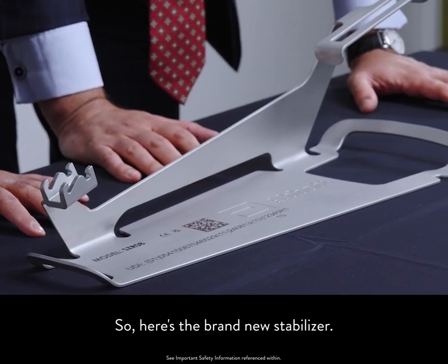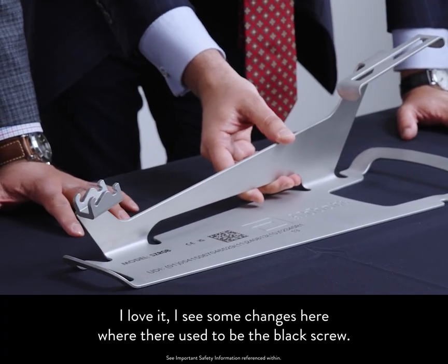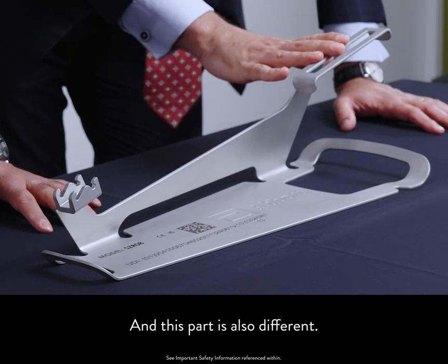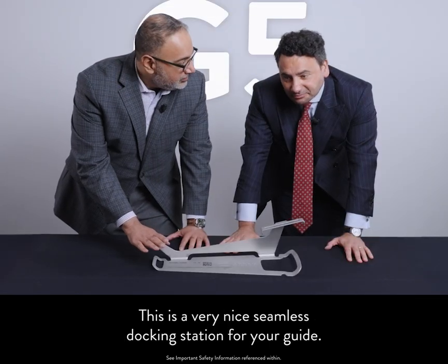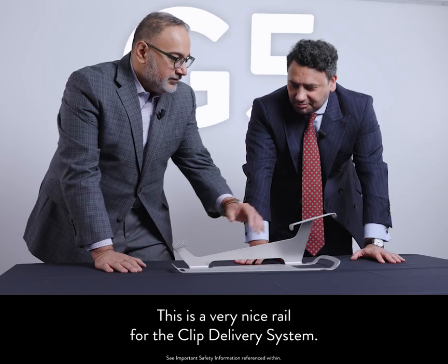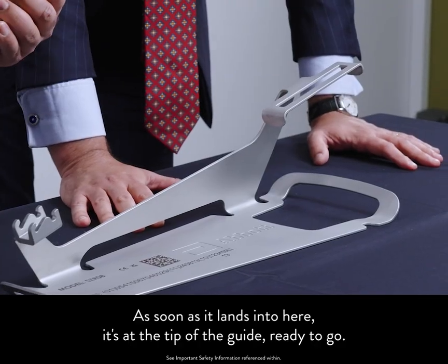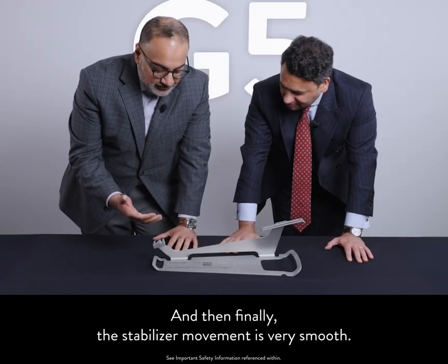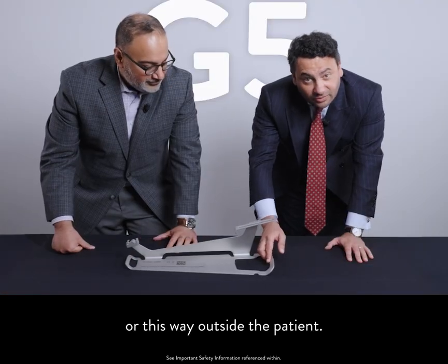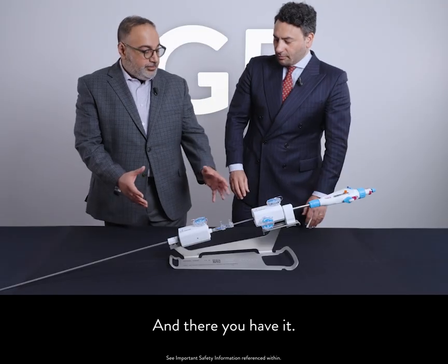Here's the brand new stabilizer. It's completely different. I see changes here where it used to be the black screw. This part is also different — this is a very nice seamless docking station now for your guide. No more fastener, no more losing the fastener. This is a very nice rail for the clip delivery system. As soon as it lands here, it's at the tip of the guide ready to go. And the stabilizer movement is very smooth — you can push it into the patient or outside the patient.